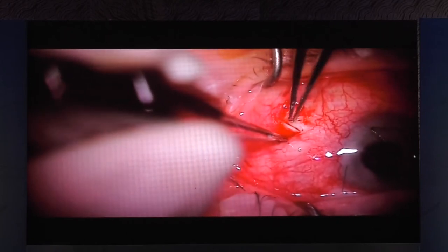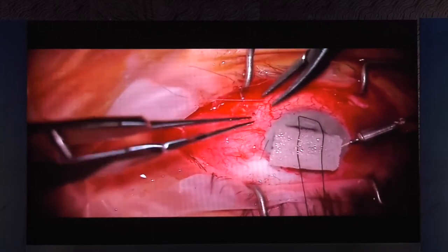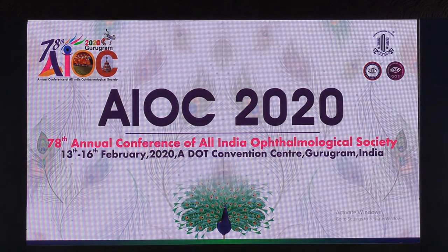That's one side. This was done 1 week after the patient's symptoms of sudden pain, AC shallowing, and low pressure, even though he had a suprachoroidal hemorrhage postoperatively. There we go. So we do a second side 180 to 90 degrees away from the first sclerostomy side. We leave the sclerostomy open and we close the conjunctiva over it. And that usually does the trick. And I keep my AC maintainer on to keep the flow going.